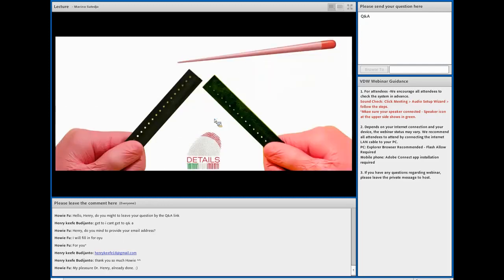And what we can do, you can use a gutta percha gauge in this case to gauge your gutta percha. For example, if you finish, let's say, with M2 25/06, I suggest you don't take 25/06 gutta percha if you want to do the warm vertical obturation technique. If you want to use single cone, it's another story. But if you are talking about three-dimensional obturation, filling all the spaces, single cone is not advisable for this kind of obturation technique. But if you want to use warm vertical condensation, in this case we need to plasticize our gutta percha and condense it and make it packed as a homogeneous material. Definitely I suggest you take taper 4 of gutta percha. Because sometimes if you use taper 6 with the same taper, the fit is not on the apical area, but in the body of the gutta percha.